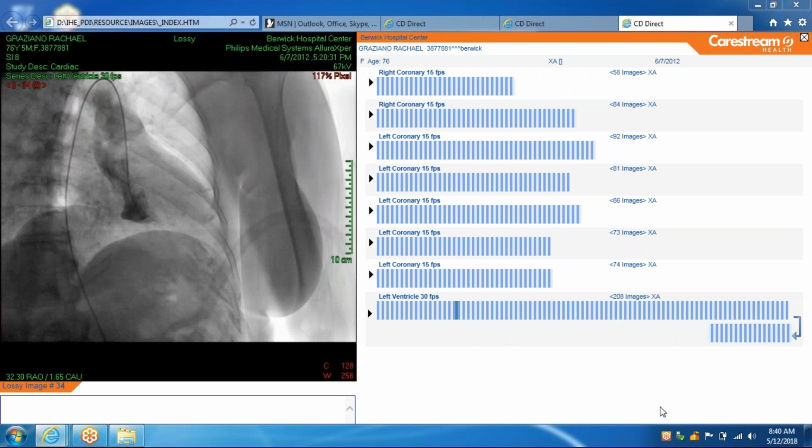All right, so again, I'm doing more radial approach now, so you're not going to see your catheter coming up like this. The catheter is going to come from the upper extremity, usually the right side. So going forward, we're going to be doing more radial approach.